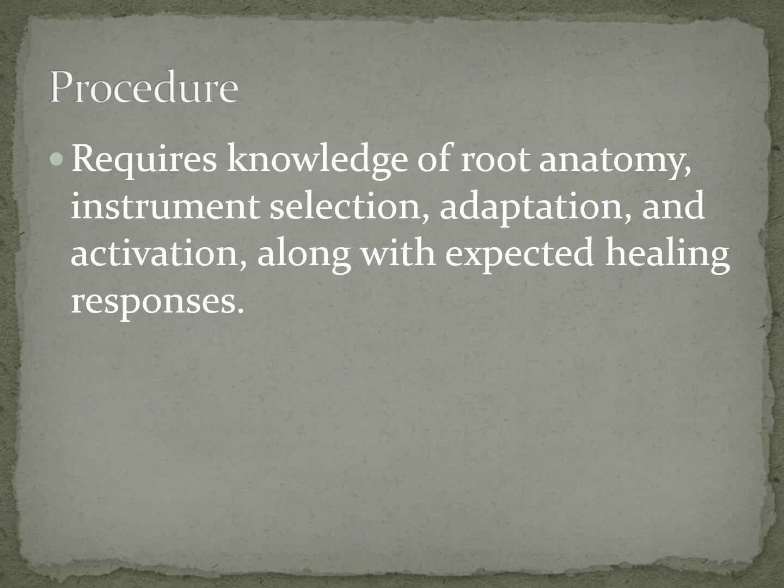So the procedure itself is going to require knowledge of root anatomy. Like if we're using our piezo and we only have the lateral surfaces that are active, then we need to know exactly how we need to adapt that to the tooth. So adaptation and activation, as well as our expected healing responses. So we need to look at our patients' overall health. We may need them to use a rinse at home afterwards to help with healing, but it may make their tissues just a little bit sore.